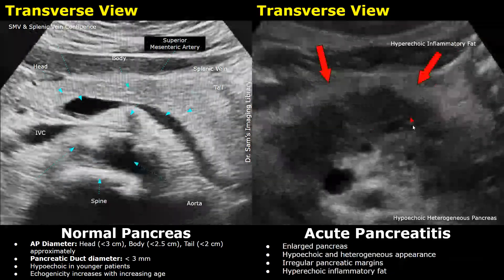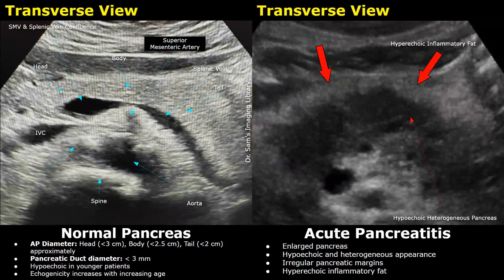This is a normal pancreas in an older patient. The echogenicity of the pancreas is higher than in previous normal images. With advancing age, there is fatty replacement of the pancreatic parenchyma, which is the reason it appears hyperechoic, but it still has a homogeneous echo texture.